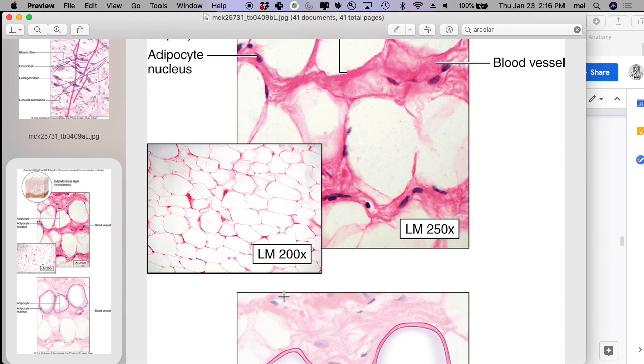But what it really is, is loose areolar connective tissue plus boatloads of cell division in your adipocytes. That's why it's a loose connective tissue, because it started out like this and ended up like this. It's still got all of these fibers, even though, can you label the collagen fibers? No, because they're smashed between the adipocytes.